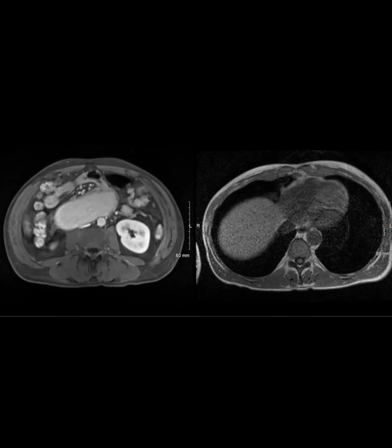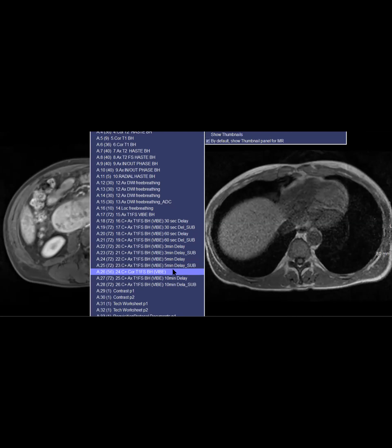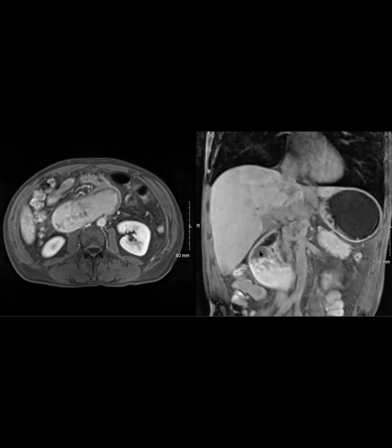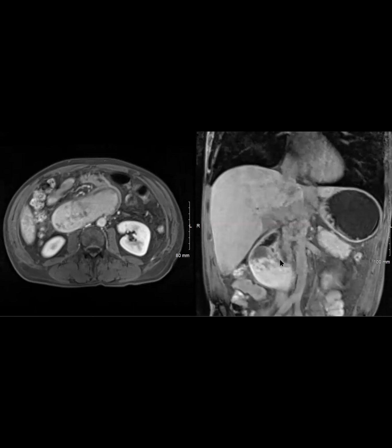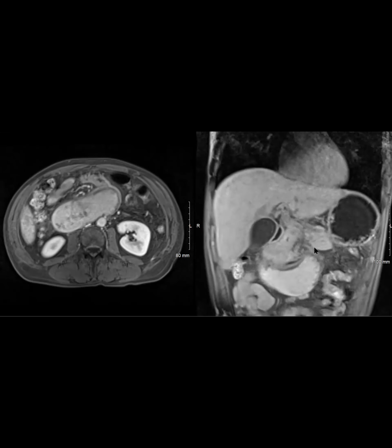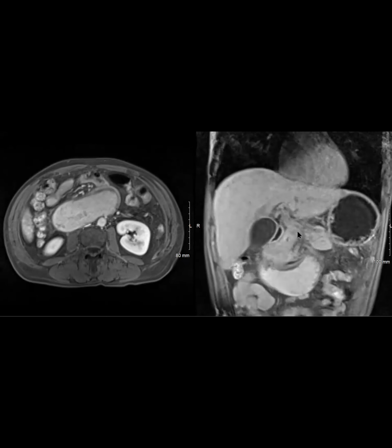And anyway, so then this big collection. I don't have a good answer for it, but it's a very unusual rapid development for a pancreatitis related collection, but it has to be something like that. So it looks like some sort of hemorrhagic process that dissected along the wall of the duodenum. I've never seen pancreatitis do this, but I guess maybe one of these small vessels got eroded or something, and there's just a big duodenal hematoma as a complication of acute pancreatitis.